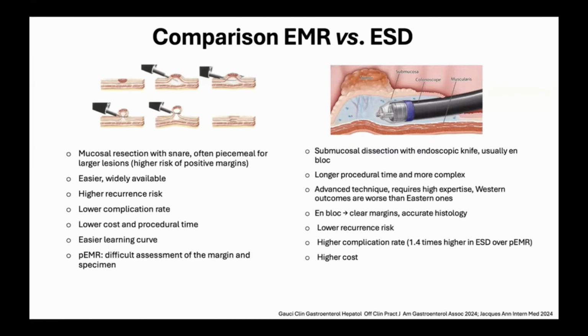So all in all, ESD nowadays, even in the Western countries, is very safe. And nowadays, there are more and more endoscopists performing ESD, especially younger endoscopists, because ESD has spread a lot across Europe. We don't have to go to Japan anymore to learn ESD. We can learn it here in Europe. We have excellent centers. And what are the main benefits?